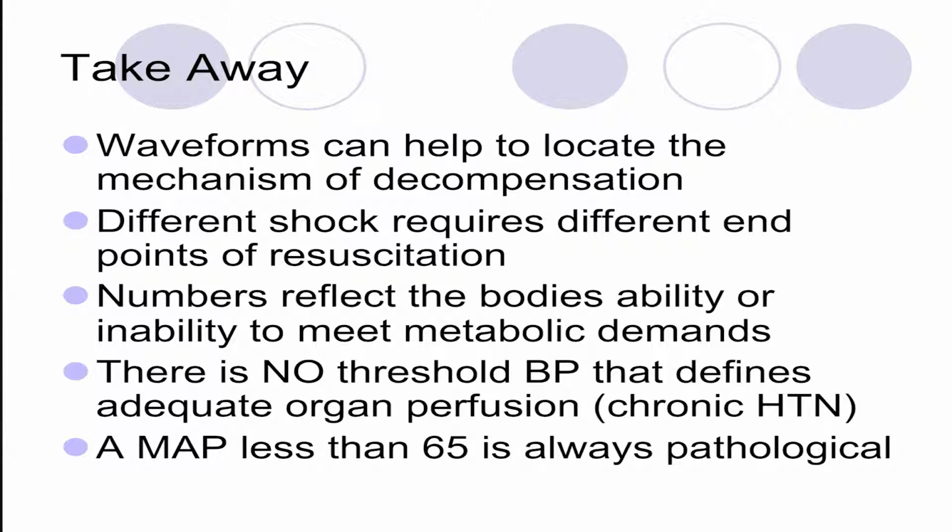As we add pressors to patients, you can see these waveforms change dramatically, because as we're changing the systemic vascular resistance, giving the heart something to work against, you can really see this reflected in CVPs, because if you're putting on a right heart strain based on what you're doing, you can see those changes. So that's something to take back to somebody else. I've started Levophed, but I'm seeing a rise in my A waves. It just helps everyone else to know this heart's under more strain.